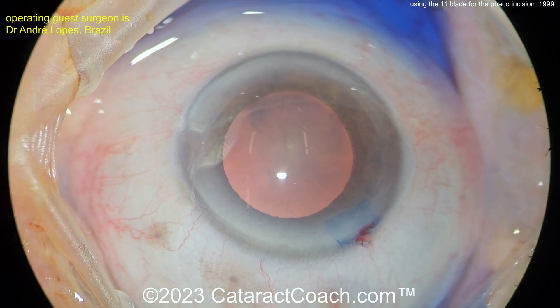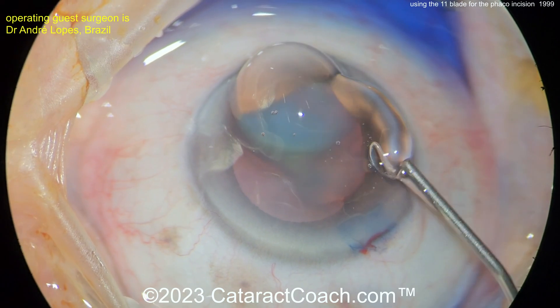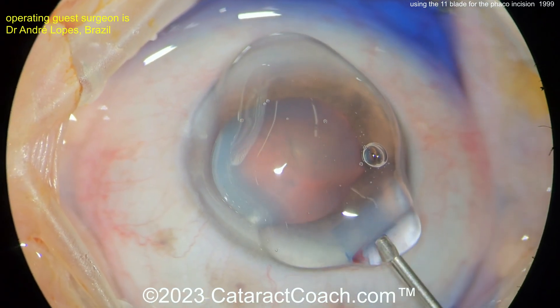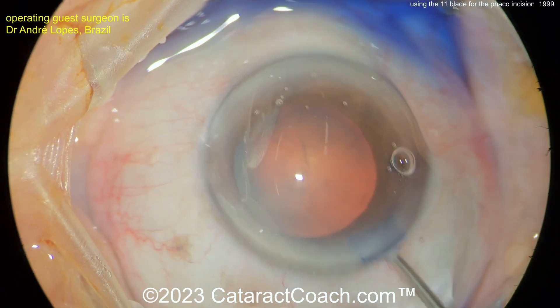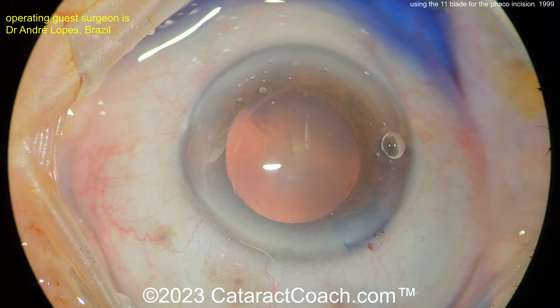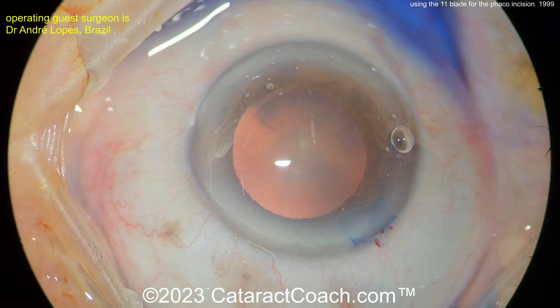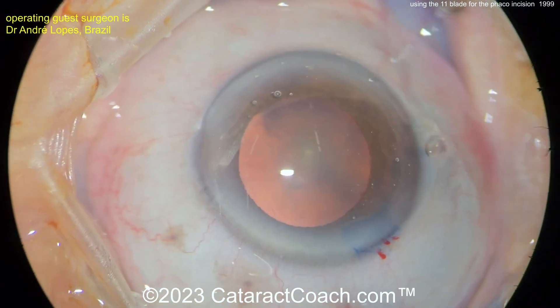Some surgeons in their facilities, this is the standard they're doing. You can see that incision turned out just beautifully — as good as you could make it with a very expensive keratome, and obviously for a fraction of the cost. These 11 blades are so cheap you can certainly use a new one for every case. Here now this paracentesis looks like it's being made with a needle — beautiful.